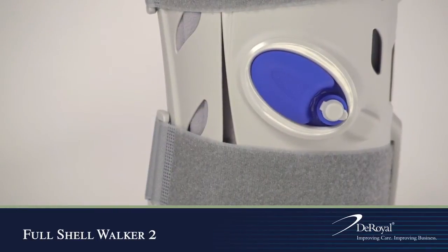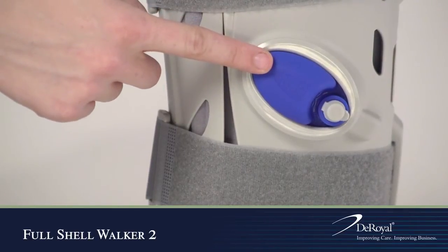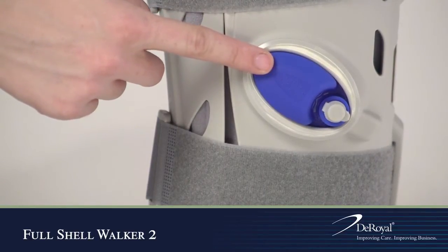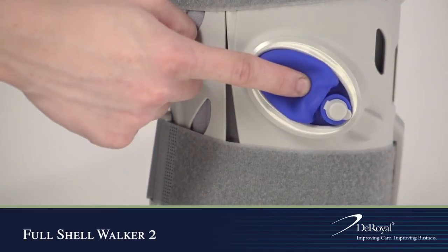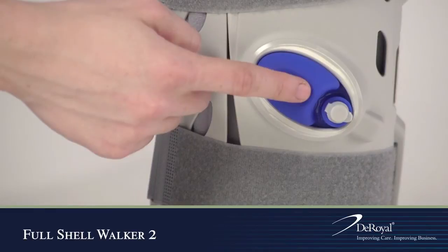The DeRoyal Full Shell Walker 2 provides customizable compression via the left and right air bulbs that are built into the device. Adjust air bladder compression by pressing the bulbs on either side of the boot until a snug and comfortable fit is achieved.